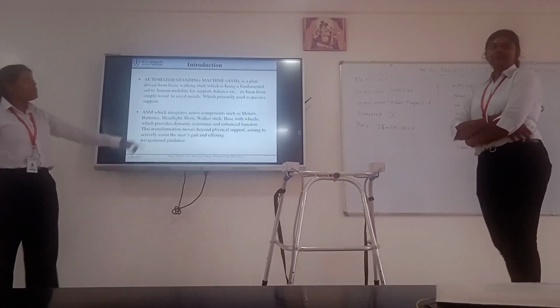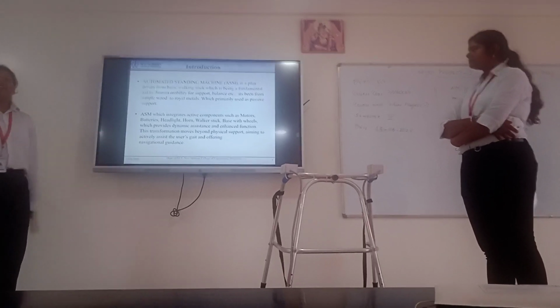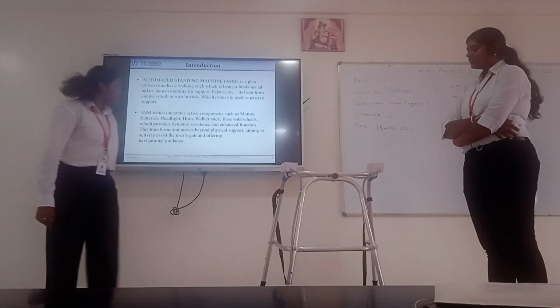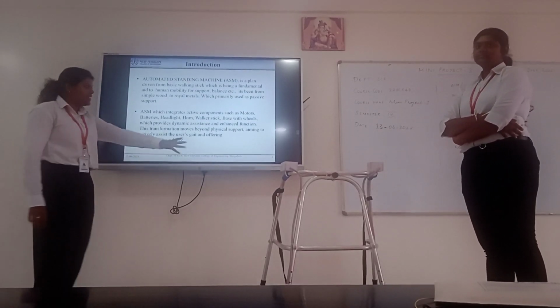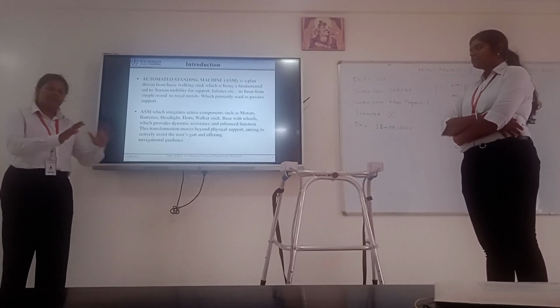So that's why we use a stand which primarily uses a passive structure, integrated with active components such as motors, batteries, or LEDs, along with wheels. This transformation moves beyond physical support, aiming to actively assist people and help them to move freely.